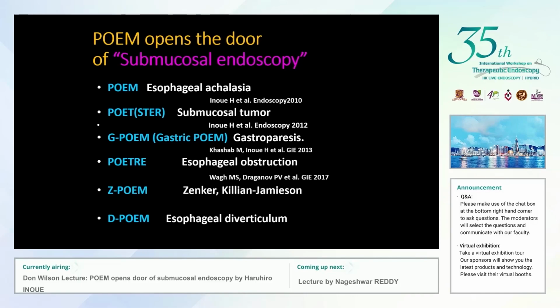So this is the last slide. POEM opens the door of submucosal endoscopy. So now we apply this technique to our several GI tract diseases. Thank you very much for your kind attention.